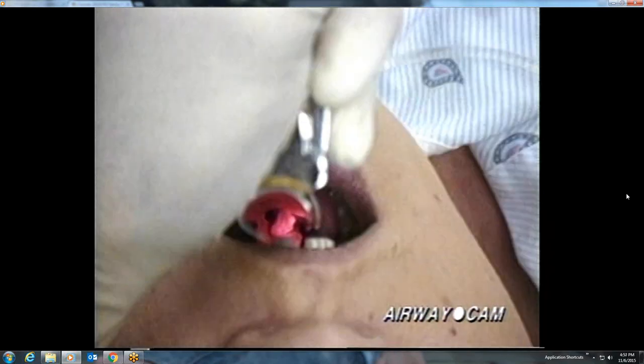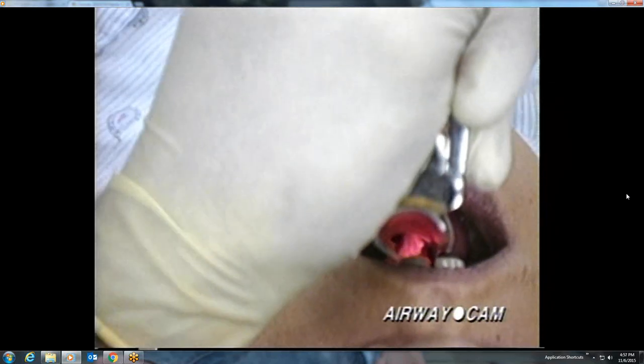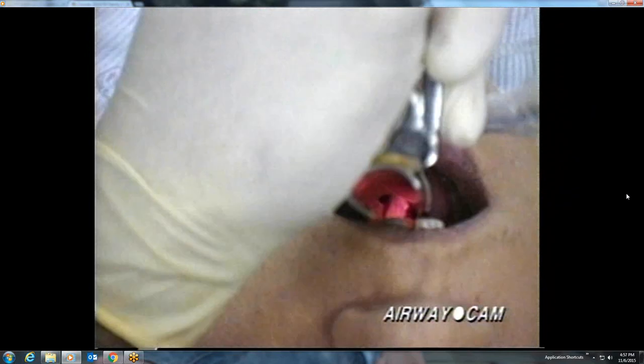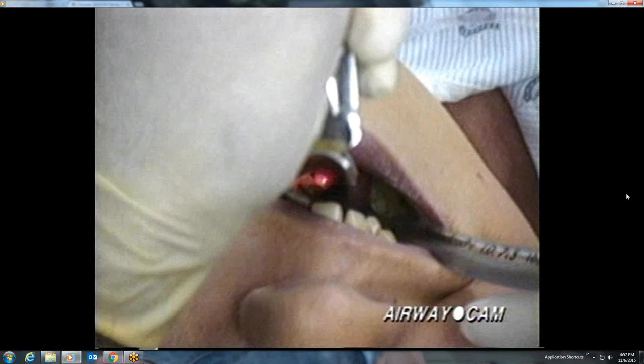Finally, the posterior cartilages and glottic opening are seen and an attempt is made to pass the tube. On the right side of the mouth, however, is a trapped section of tongue. The laryngoscopist cannot advance the tube around this trapped section. The epiglottis falls down again, and the laryngoscopist continues to struggle trying to advance the tube. After several more efforts, this intubation attempt is ended.